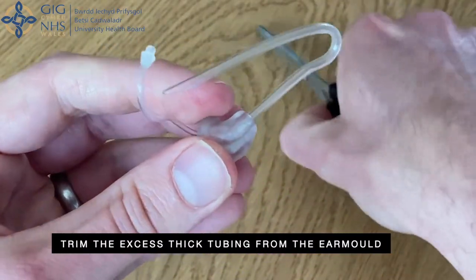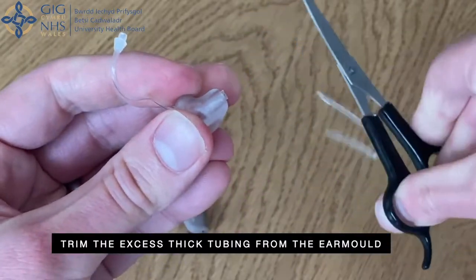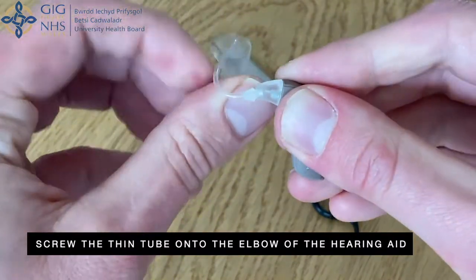Trim the excess thick tubing from the ear mould. Screw the new thin tube back onto the elbow of the hearing aid.